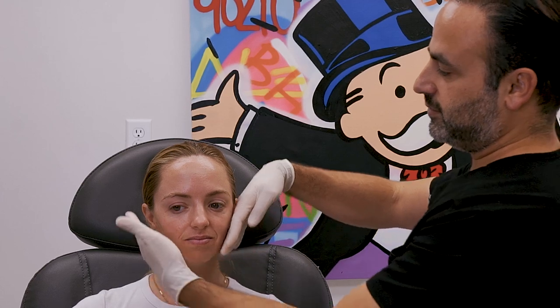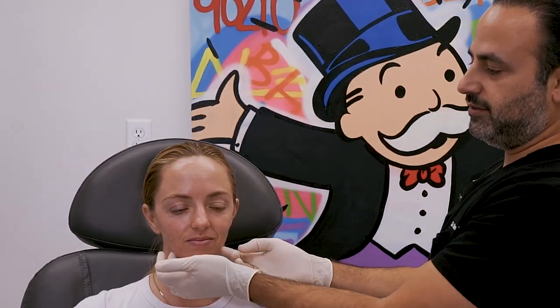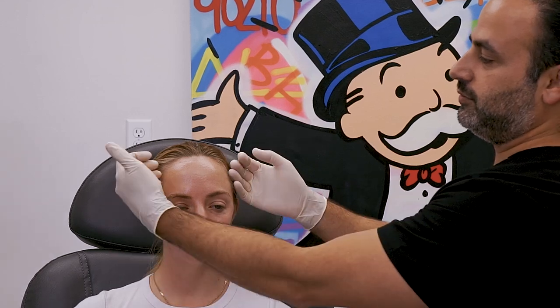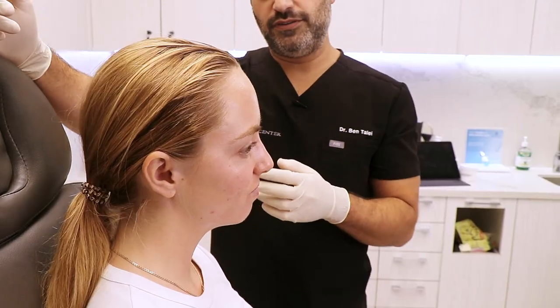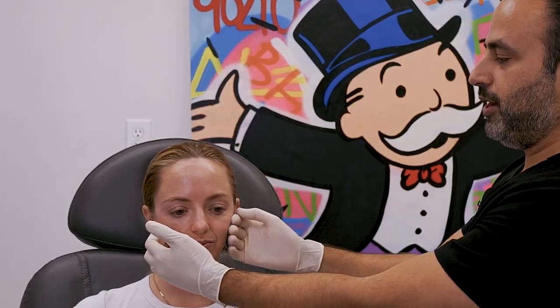Not really to make her look younger or less tired — she looks fine. If you look at the face, it's very triangular. She comes from a narrow chin that's slightly recessed, a little bit of a weak jaw, but then comes to more prominent temples and frontal part of her head. With that, you don't want to make her pop out this way or that way, because then everything ends up looking big. We want to play within our boundaries and keep her exactly as she is and do low volume changes.